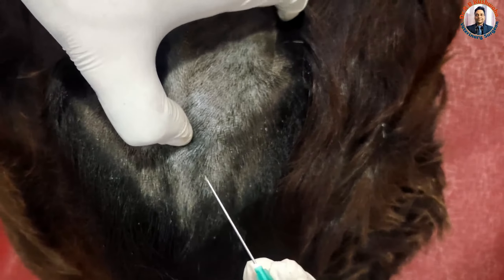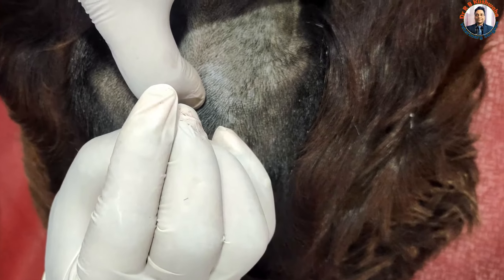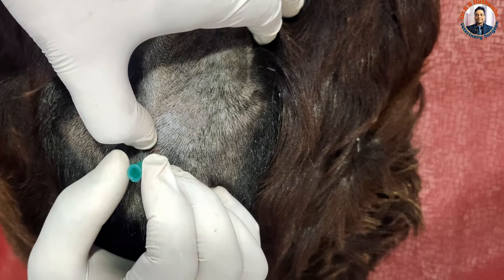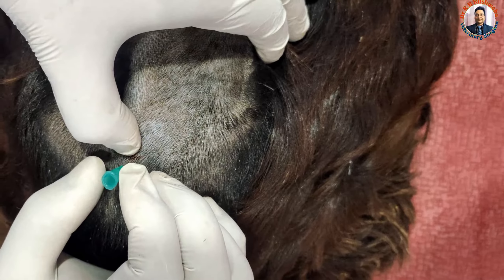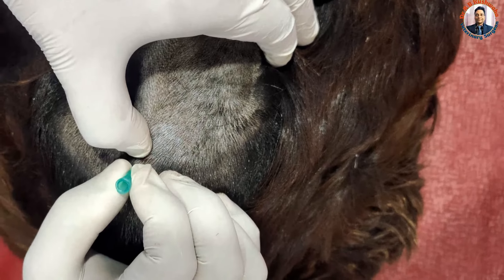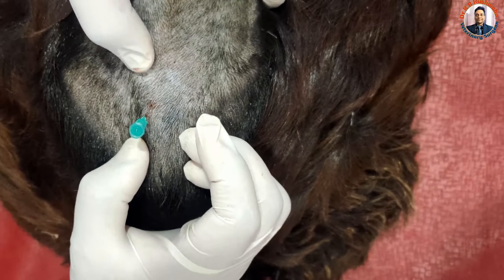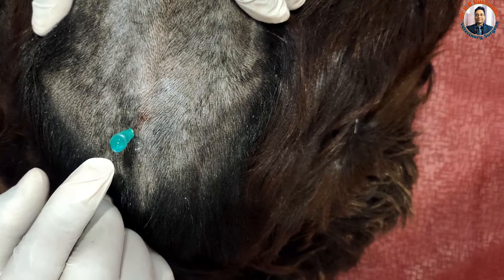We take a 21-gauge hypodermic needle, which is available with a drip set, and prick it into the lumbosacral junction. Then slowly we advance it into the subarachnoid space. Fluid was not coming at first, but now it is coming — probably because the pressure was low. You can see the oozing of cerebrospinal fluid.